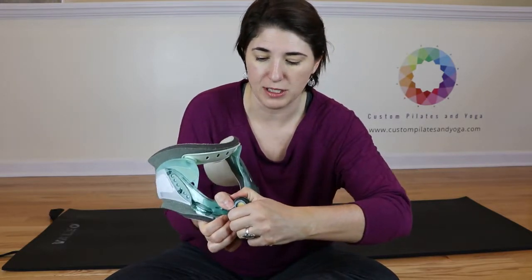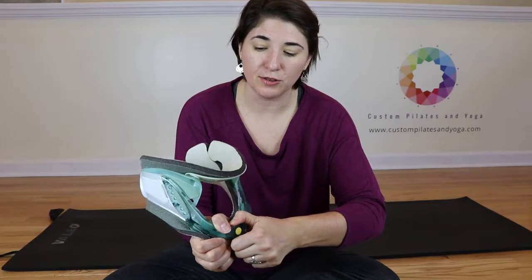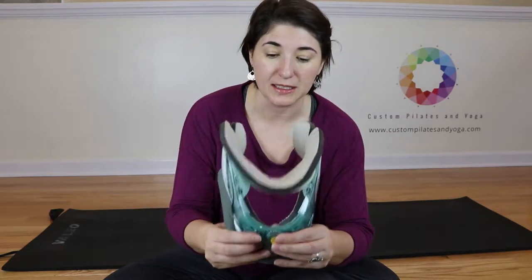And you can pull that out. You pull it out and then you turn and it helps to adjust that up and down. And then you release and it comes in and it sets.